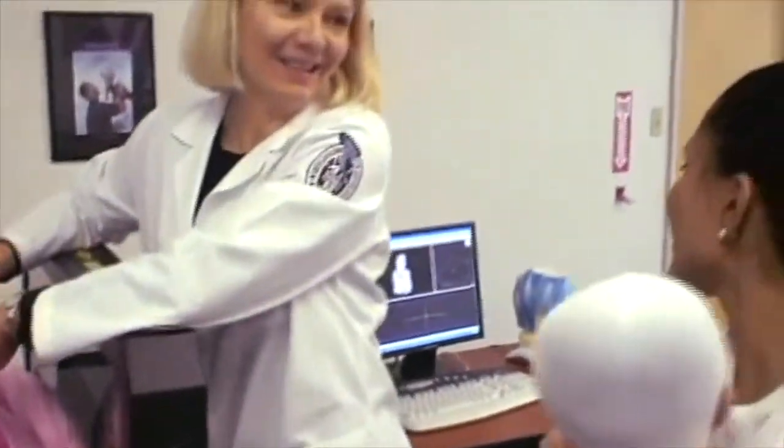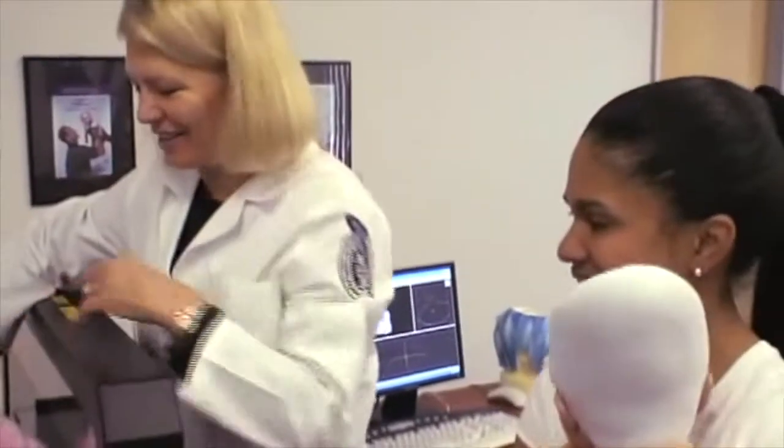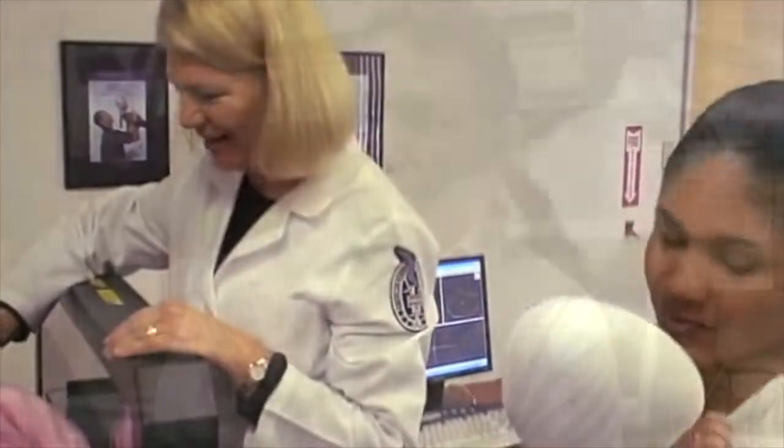That scan was perfect. Wow, and that's all there is to it. Excellent. It really is great technology.